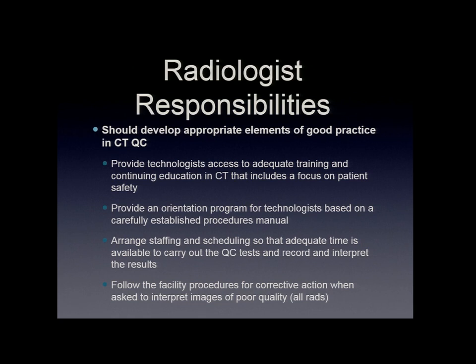So there's more patient safety specific to CT that's starting to be a part of this whole team effort. The radiologist really is supposed to be overseeing that this is completed, because he is the essential leader of the team. And then, of course, you need to have the technologist put together the procedures manual along with the physicist, and then make sure that's maintained and that it's being followed. And make sure there's time for them to perform these tests, to record it, to make sure that they have time to evaluate it.